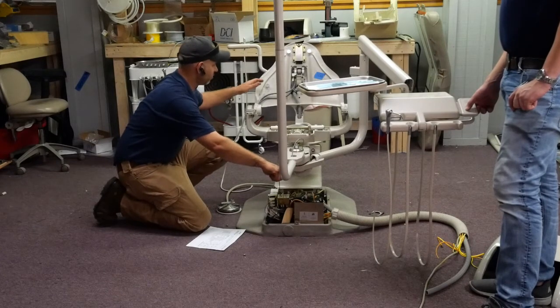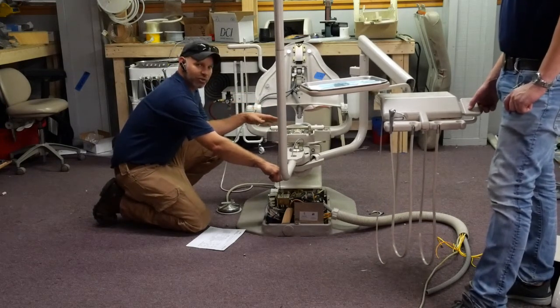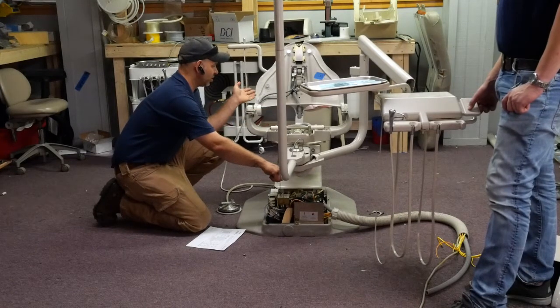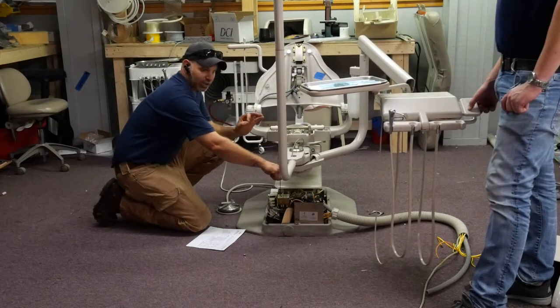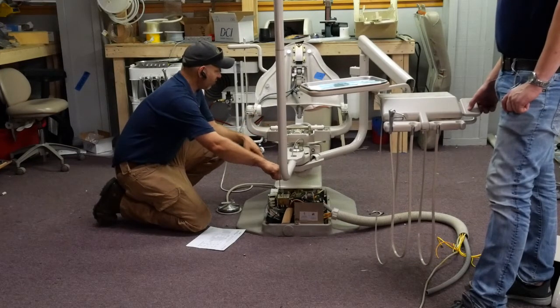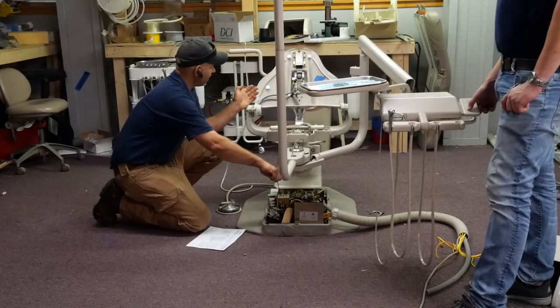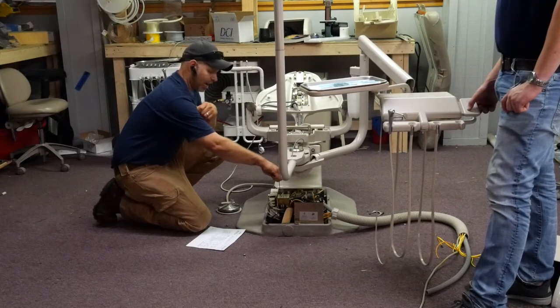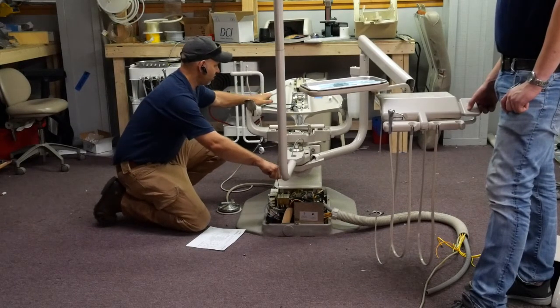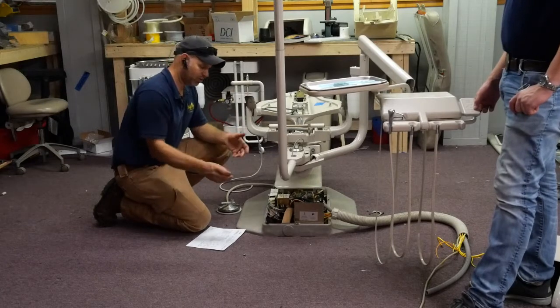All right. Now, the thing to know is that the back down function is actually a single acting hydraulic cylinder, and there are 2 gigantic springs that return the chair back to normal position. So when you click that, notice that the hydraulic pump is not running. It's just allowing the oil to move by this point. As I open this up, you're going to see that it starts to go down quicker. All right, see that? So that's all the way open. And again, if I close it, it'll stop. So you can adjust your speed by adjusting these 4 valves, and you just want to pick the parameter that you want to adjust.